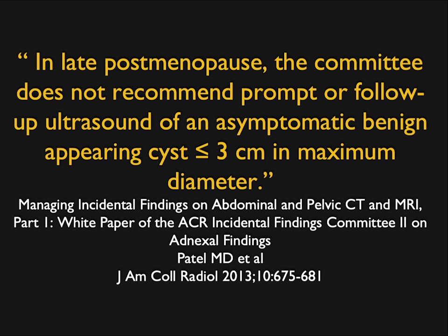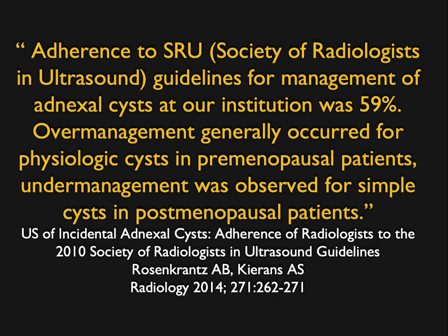Now that's the radiology guidelines. There are ultrasound guidelines from the Society for Ultrasound. One of the things, of course, is do people follow the guidelines? Rosencrantz wrote this article that people don't. Adherence to guidelines was 59%. That's NYU. Overmanagement generally occurred in physiologic cysts in premenopausal patients. Undermanagement was observed for cysts in postmenopausal.